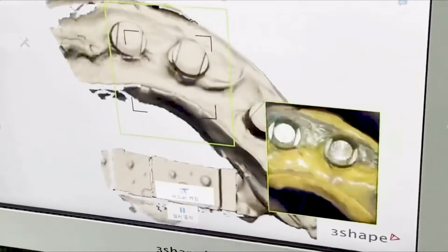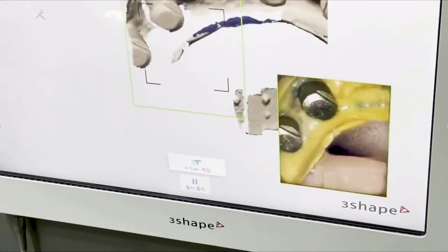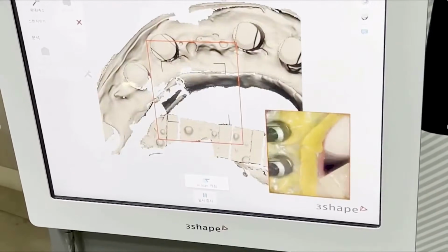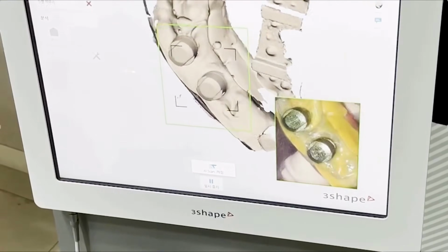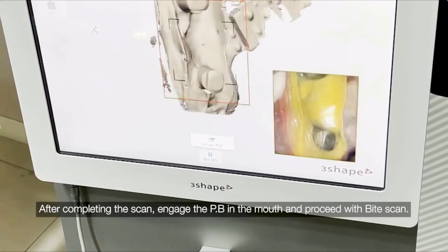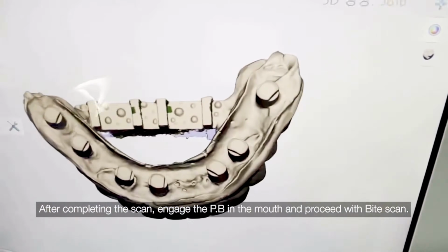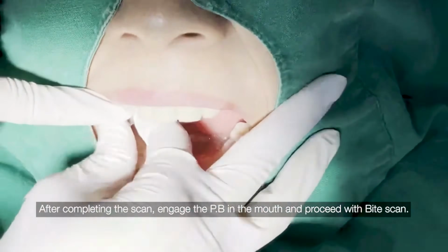The cylinder scan body used here is a product from DIO Implant Company. In this video, I am only explaining the workflow and the digital concept behind it. Cylinder scan body, reverse scan technology, capturing implant positions with digital precision. From scan to CAD design to the final restoration.